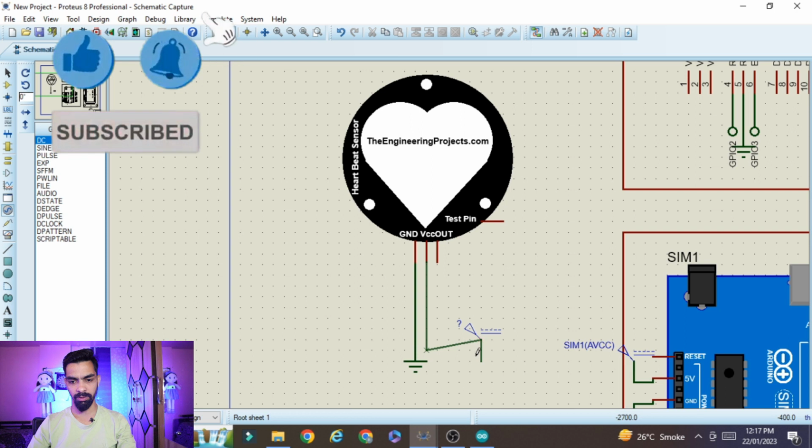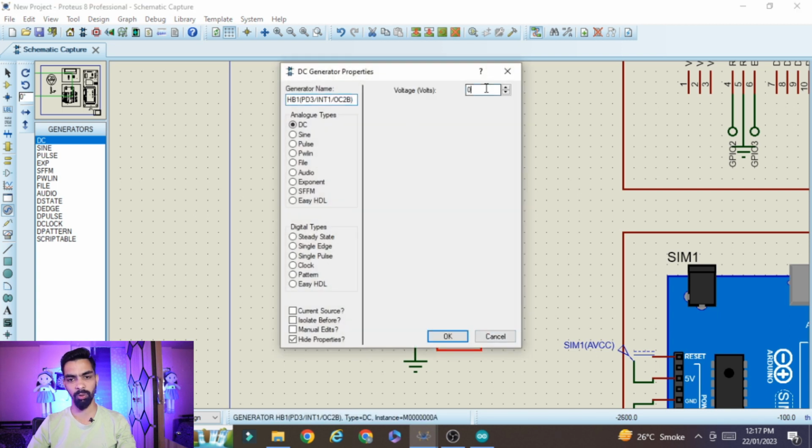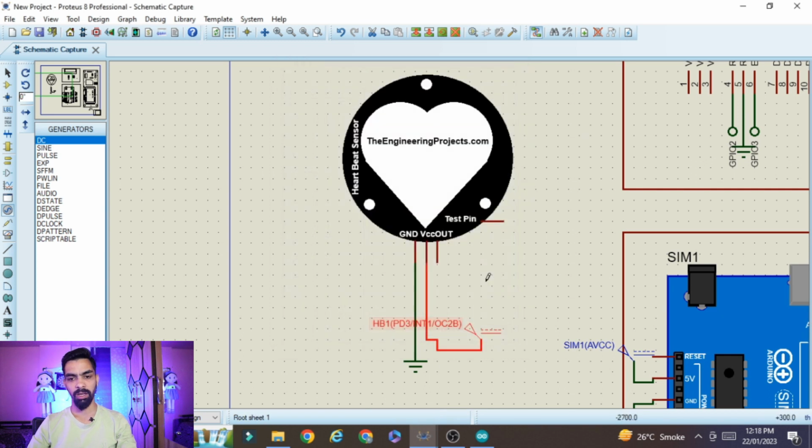You can connect like this. Then double click on the DC supply, give your voltage as 5, and click on OK. Then this test pin should be connected to a logic state.